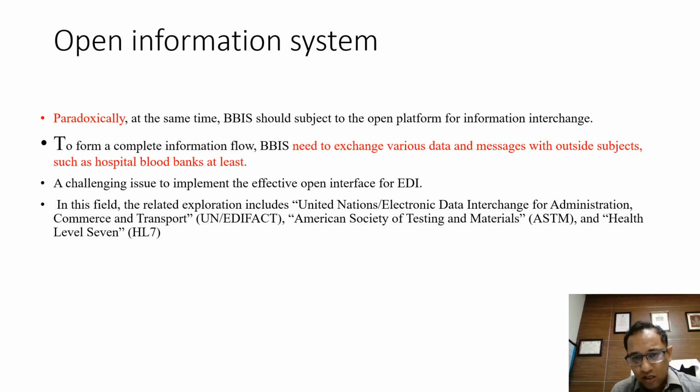Of course, there are various agencies for the same. You can have the United Nations Electronic Data Interchange for Administration, Commerce, and Transport. Or there is another, called the American Society for Testing and Materials and Health Level 7.